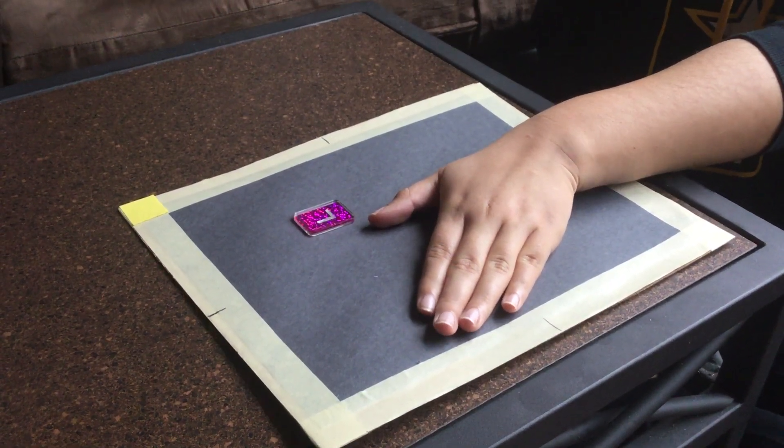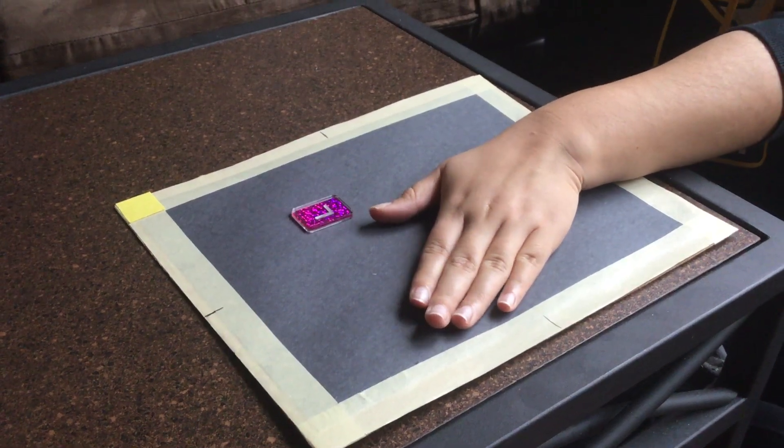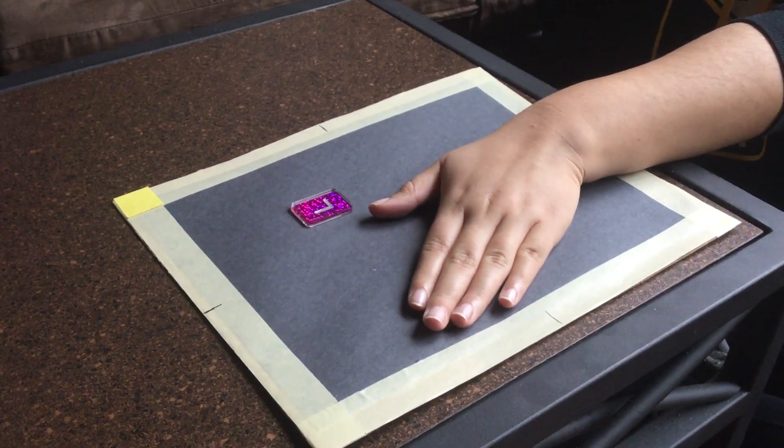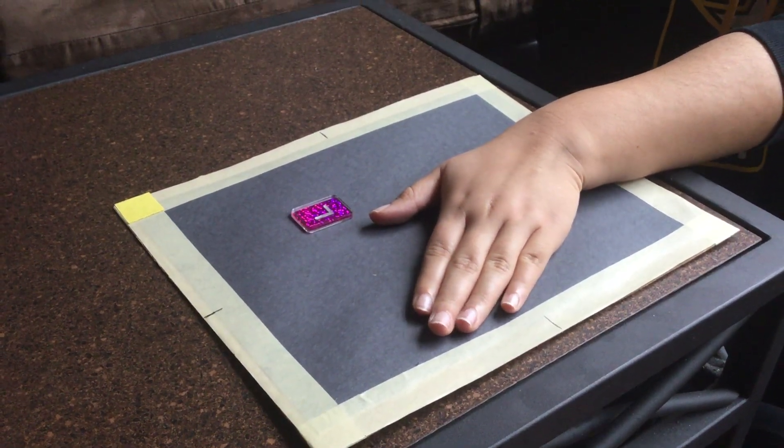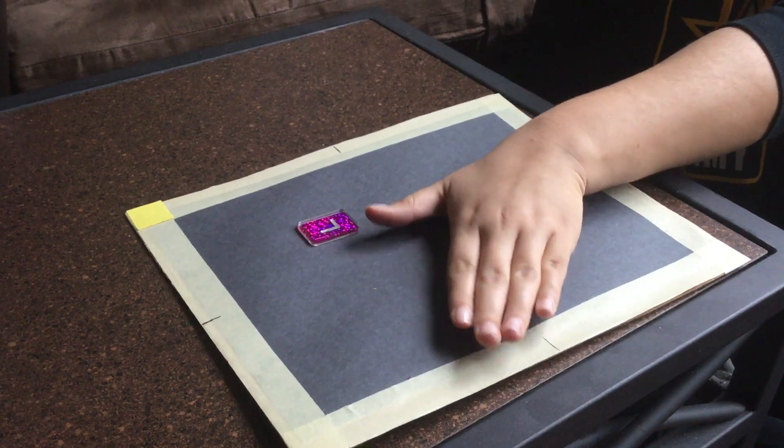The next image that we're going to do is the lateral thumb. So what we're going to do is like this.